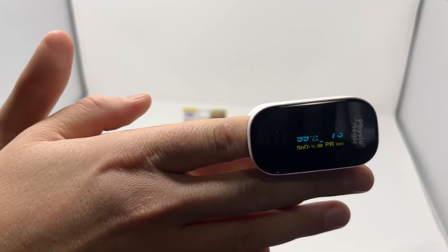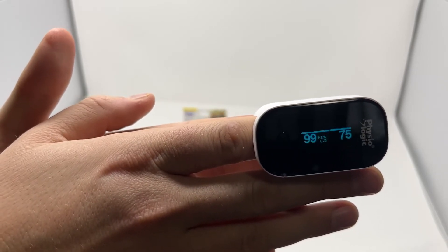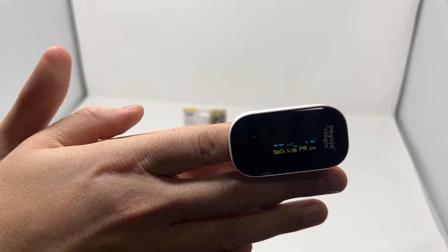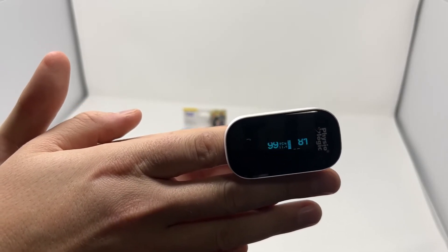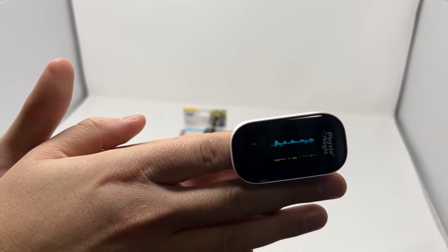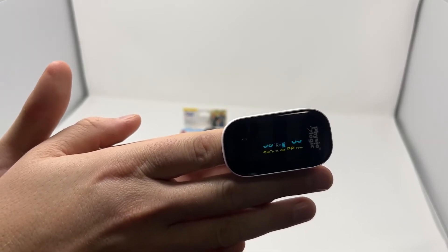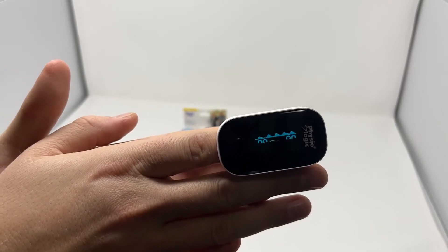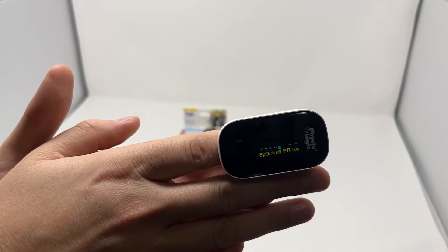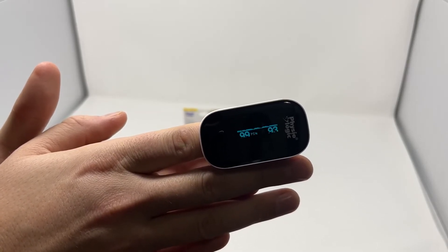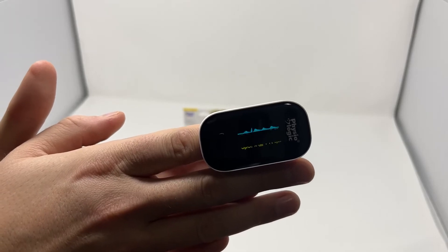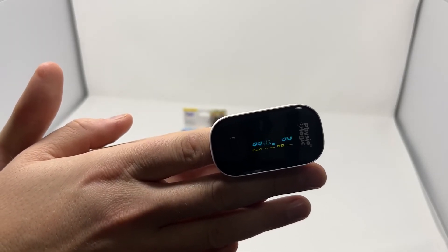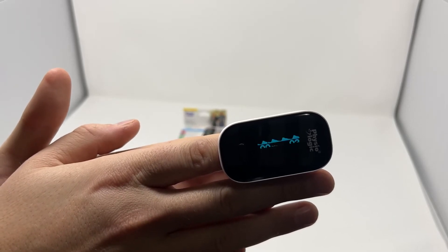Now there is a small number right to the right of that 99 and that stands for perfusion index. That's one of the advantages of this device - it's going to tell you if it's truly reading a correct measure. Perfusion index is a measure of 0.2 to 20%. Really most EMS services rely on that number. If it's between 2 and 20%, it's an accurate number. So that's a really good way to further determine the accuracy of your SpO2 along with watching for that sawtooth metric with the waveform. That should be regular, telling you it's reading a regular pulse.